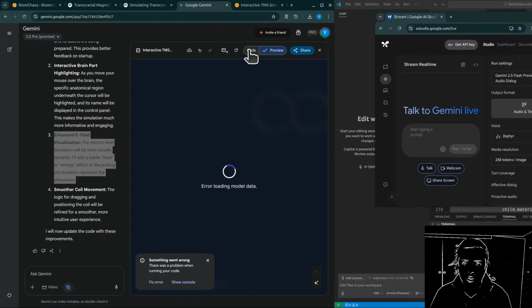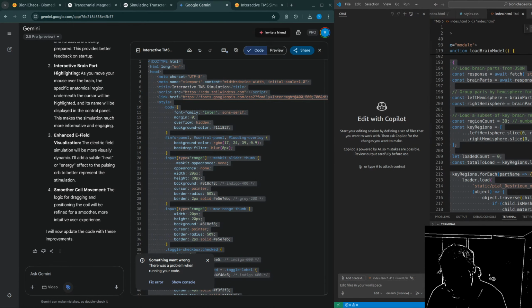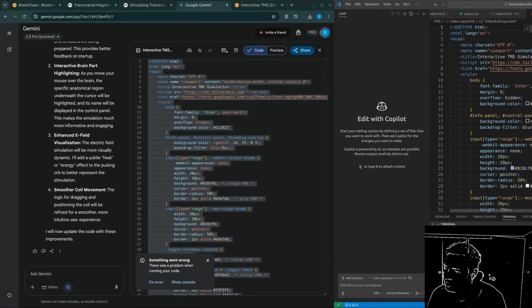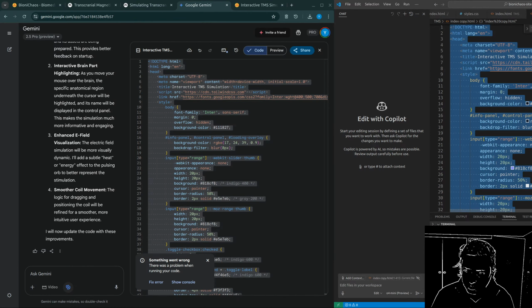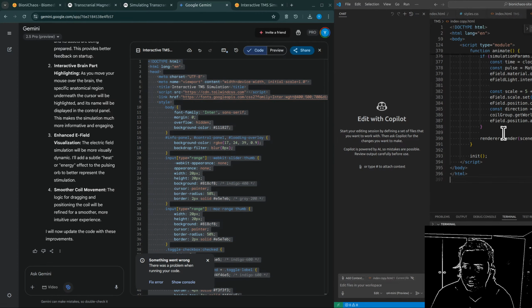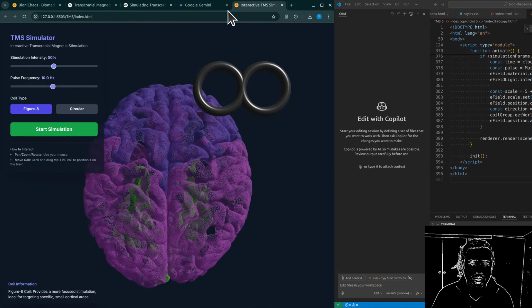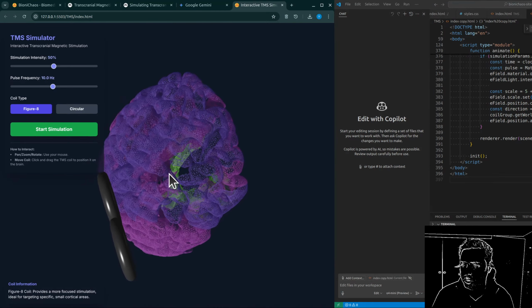It's about moving beyond a kind of one-size-fits-all approach. Towards treatment truly tailored to an individual's specific brain anatomy and potentially physiology. That's the vision, yeah. It's pretty incredible, isn't it? How much complex computational work and deep scientific understanding goes into simulating something that, from the outside, might just look like placing a device on someone's head. It really is. This deep dive certainly reveals the incredibly detailed scientific process that's aiming to make this potentially powerful technique much more precise and hopefully more impactful for patients. It truly does. It underscores the complexity, absolutely, but also the immense potential that simulation holds for guiding and optimizing these kinds of therapies in the future.